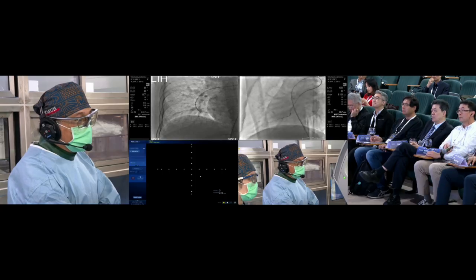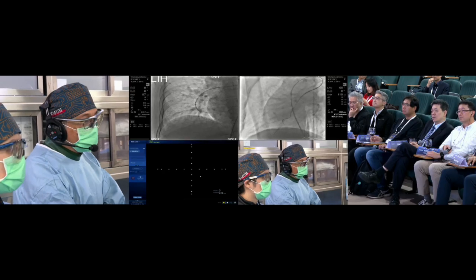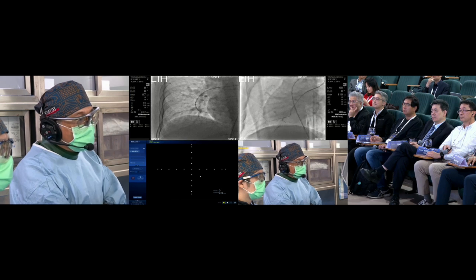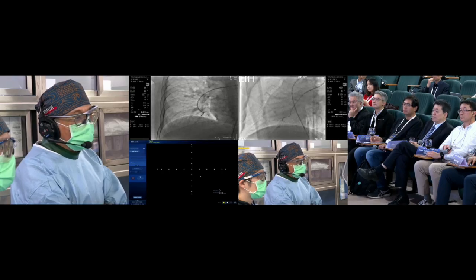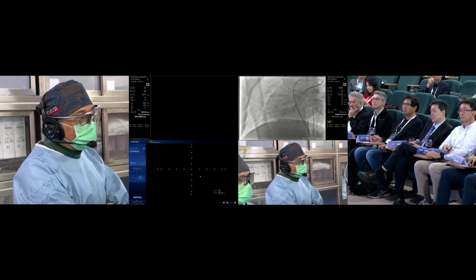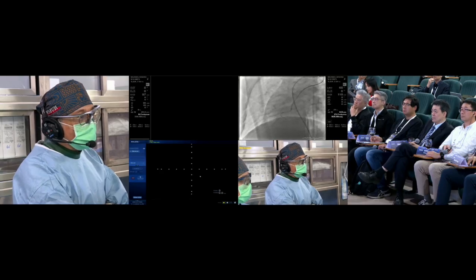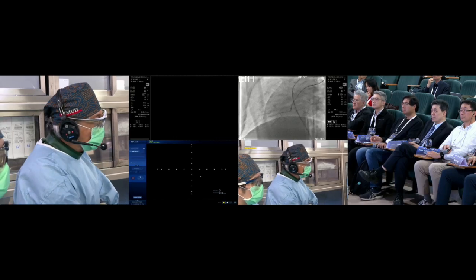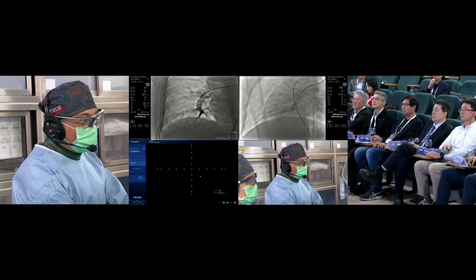For this kind of high-risk patient, we have to be very careful. So I always ask whether the patient feels like coughing, or whether they taste something bitter in the mouth, because the contrast medium tastes very bitter. If they have a vascular injury, some of the contrast will get into the small bronchial trees and the patient will cough and taste the contrast medium. In that case, we had better stop the procedure.